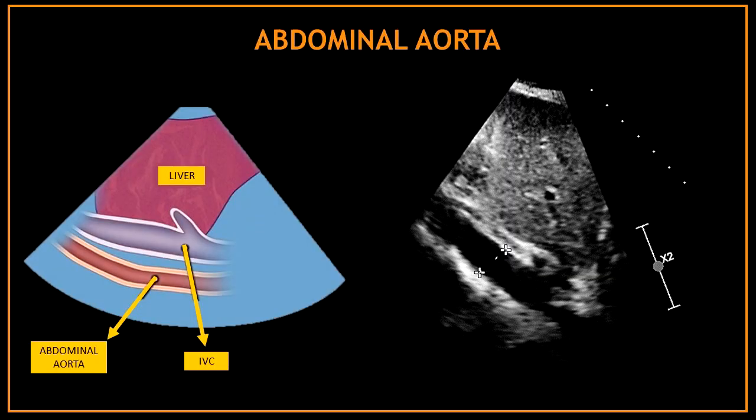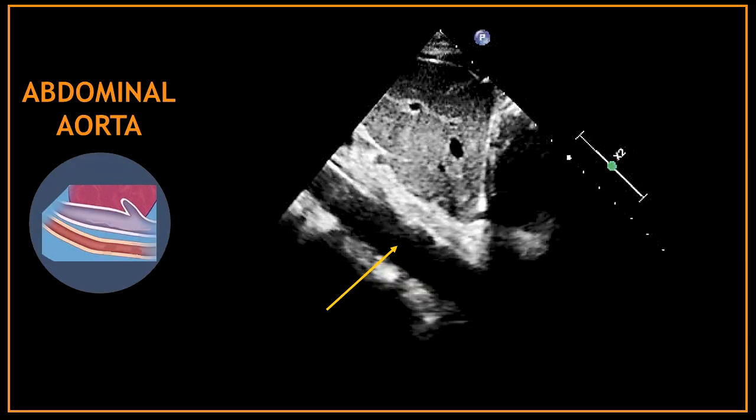One last structure you can often see in the subcostal view is the abdominal aorta. It looks very similar to the inferior vena cava, which is why it's very important to get confident in differentiating both.